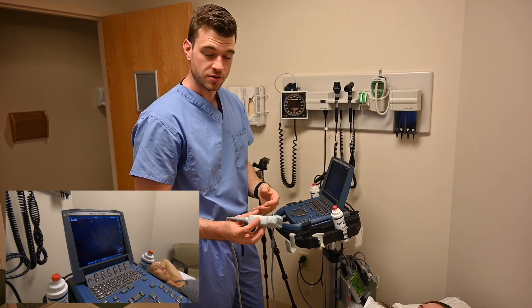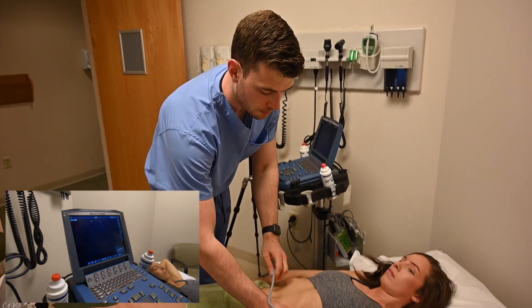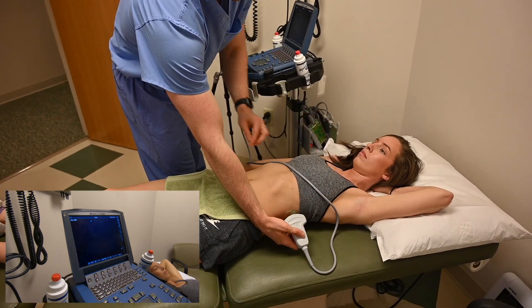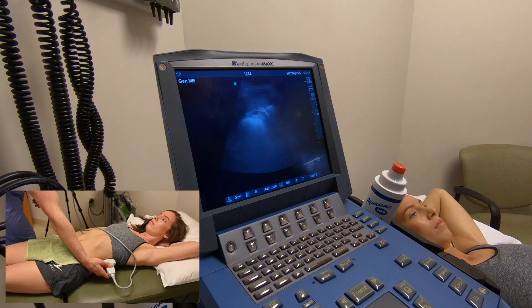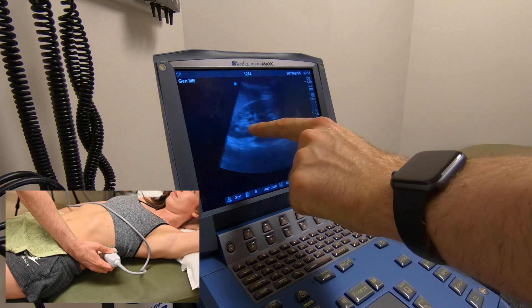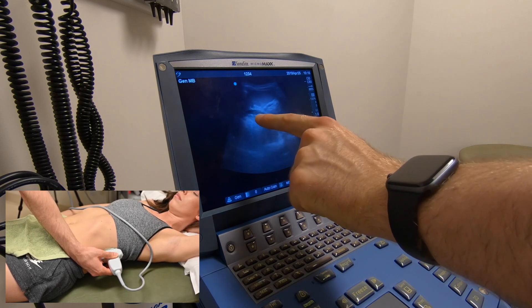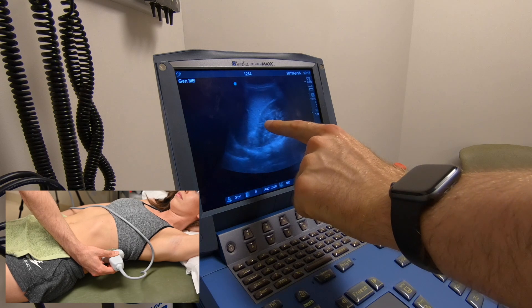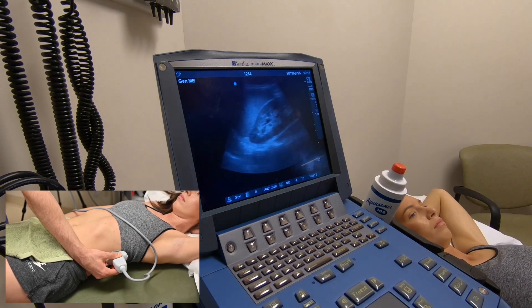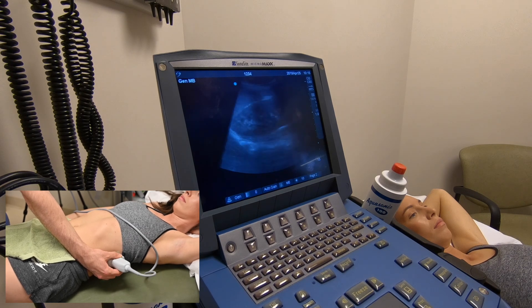Now we're going to look at the spleen interface on the left side, including the diaphragm and potentially the stomach in this view. Indicator towards the head — the general tip is to put your knuckles down and look up for that view. We can see a healthy-looking kidney popping in, and the spleen against the kidney. There's some splenic vasculature visible. We don't see any black or white striping, so this would be a negative FAST exam on this side as well. We want to get a good view through the whole kidney.